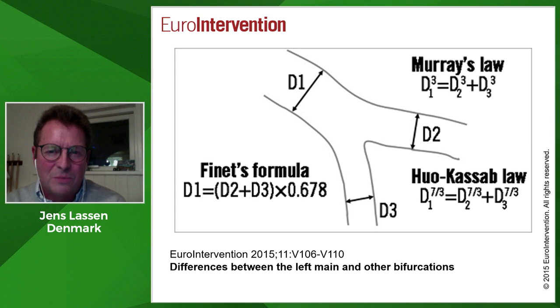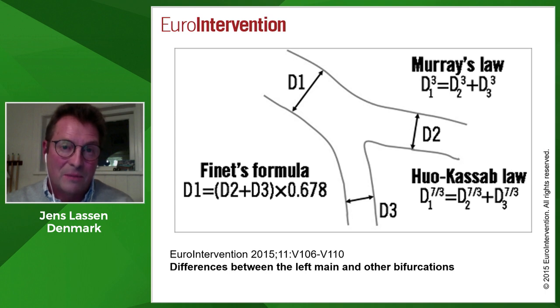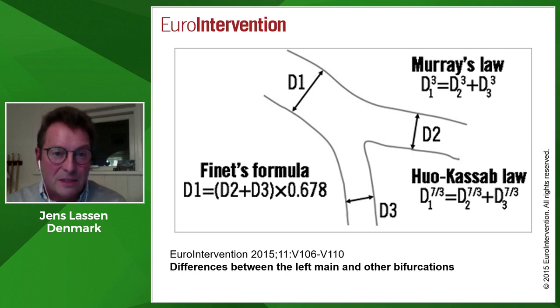And what does that mean in respect of stenting therapy? So this is actually the main important thing, because the distal diameter of the main branch is smaller than the proximal diameter. And the stent we use for treatment is tubular, which means they have the same diameter in the proximal part and the distal part. So if we implant a stent with respect to the proximal diameter, it will be over-dilated in the distal part across the side branch. And two things will happen by nature and as a consequence. First of all, we'll push the carina towards the side branch and maybe also push plaque burden towards the side branch. The other thing that will happen is an overstretchment of the vessel wall, which will make the side branch ostium oval and narrow. So this is actually a thing that is very important to be aware of. So if we go further on to the next slide, please.